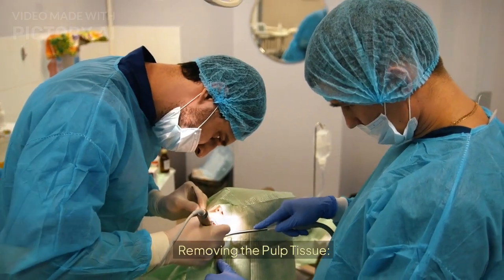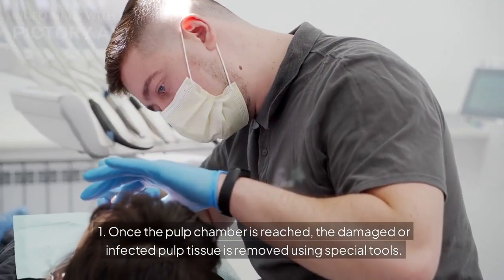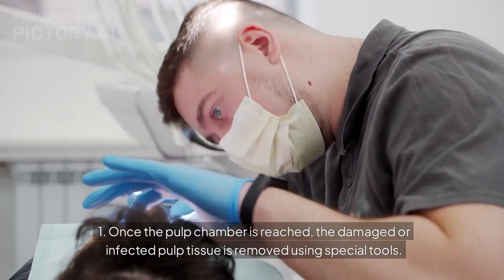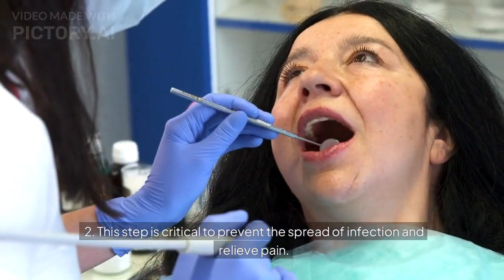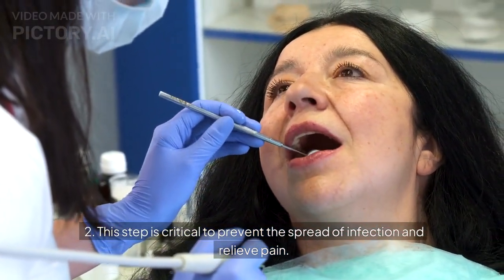Removing the pulp tissue. Once the pulp chamber is reached, the damaged or infected pulp tissue is removed using special tools. This step is critical to prevent the spread of infection and relieve pain.